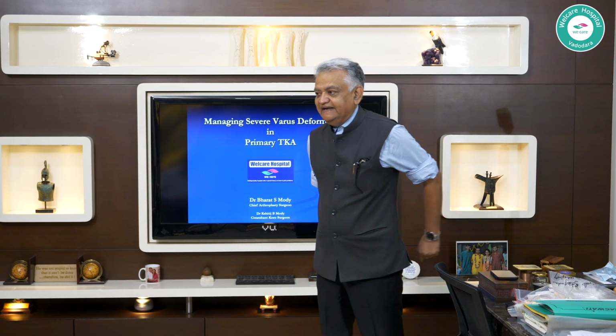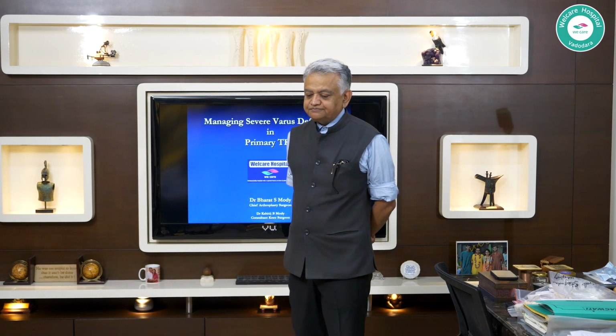And now what I suggest we do is to try and understand the nuances involved in different types of specific deformities that you will encounter during your career as arthroplasty surgeons. The most common being varus knee, and that too severe varus. By the word severe, it could mean either severe in the form of excessively deformed looking knees, or severe as in very tight.